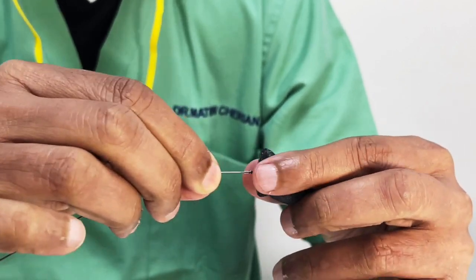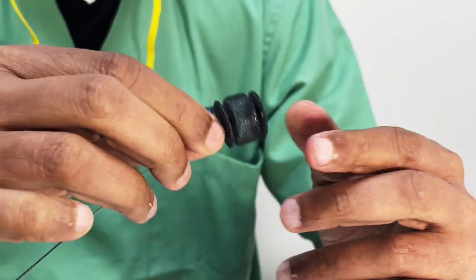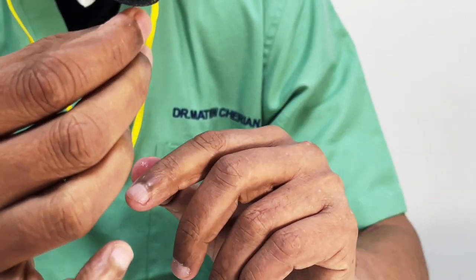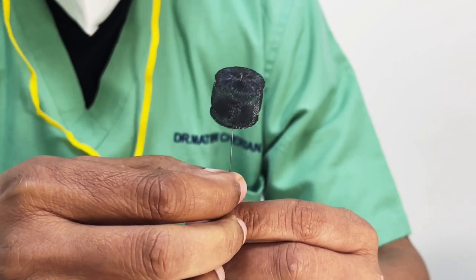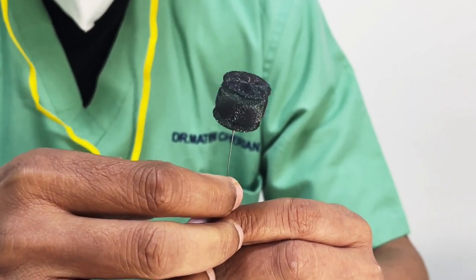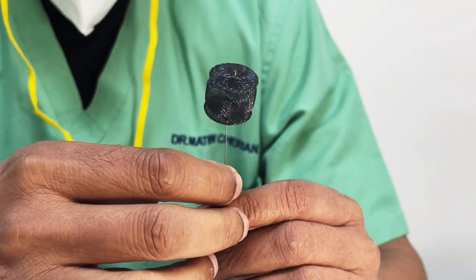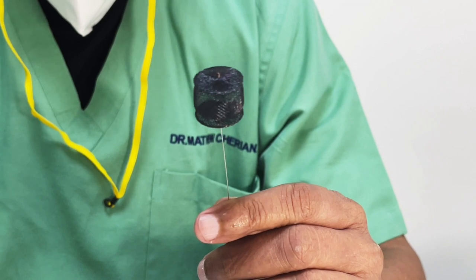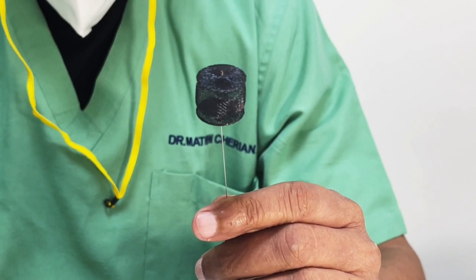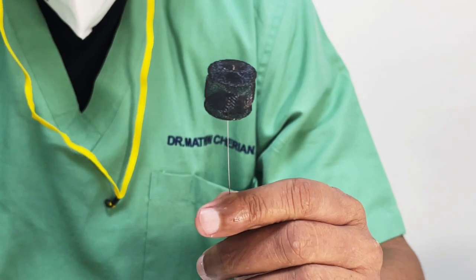And when you're very happy with the position, you go ahead and deploy it, right? So the basic fundamental, remember, there is a type 2 and a type 4. The type 2 is the one that requires larger bore catheters and come to very large sizes. Classical places we use is for AV fistulas, to take up the subclavian artery when you do a stent graft procedure, or even an iliac occlusion when you're doing a unilimb device. And all of them do very well with the Amplatzer plugs, right?